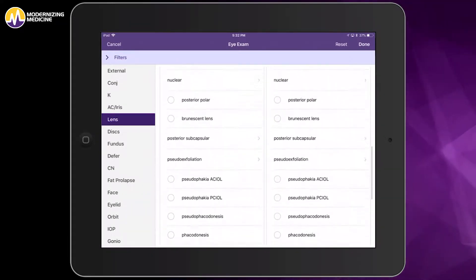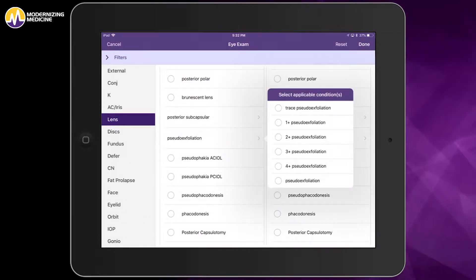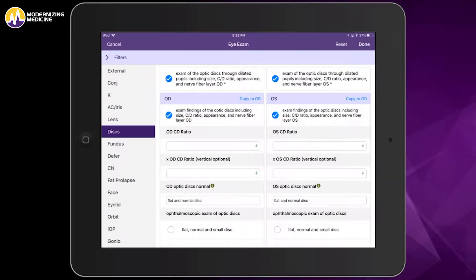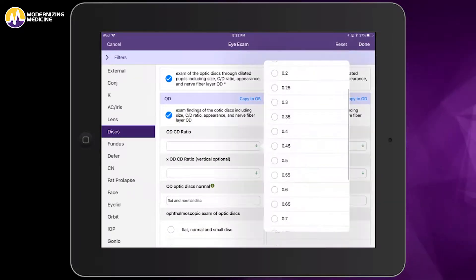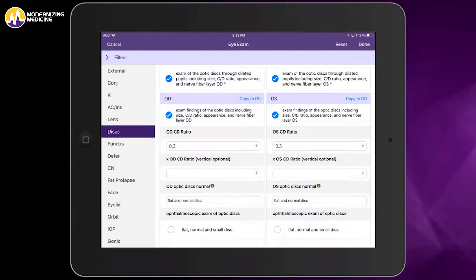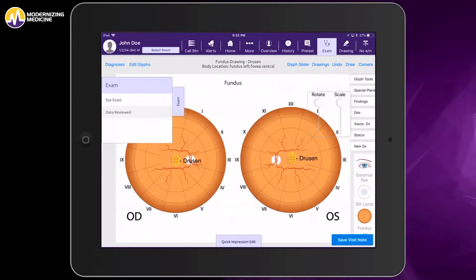When I go into the exam itself, I have the option to document findings in the exam if I prefer, but typically I just use this exam set to document a few features. Here I note the cup-disk ratio and quickly copy it to the other eye.